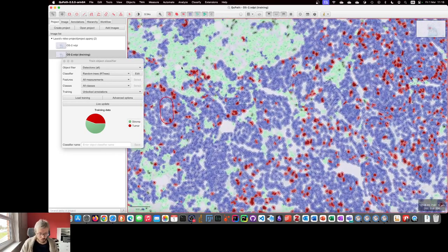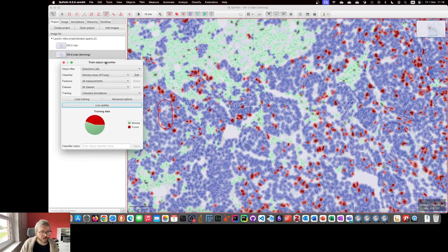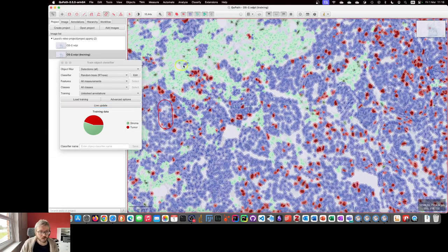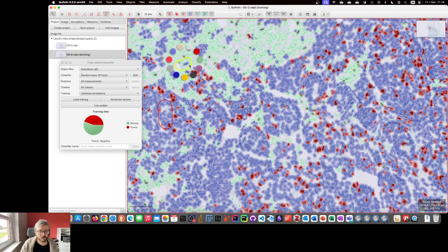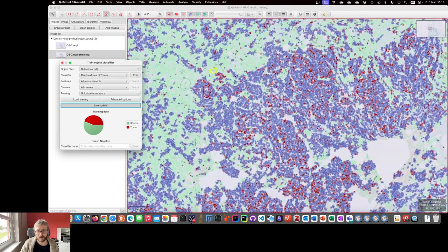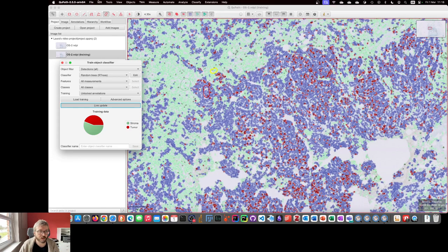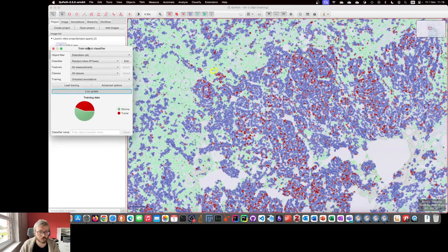So as you saw, we have this dialogue for training an object classifier. I can select a region, assign a classification, live update, and then the changes will make to the cell classifications. All of this can happen interactively despite the fact this dialogue is open.